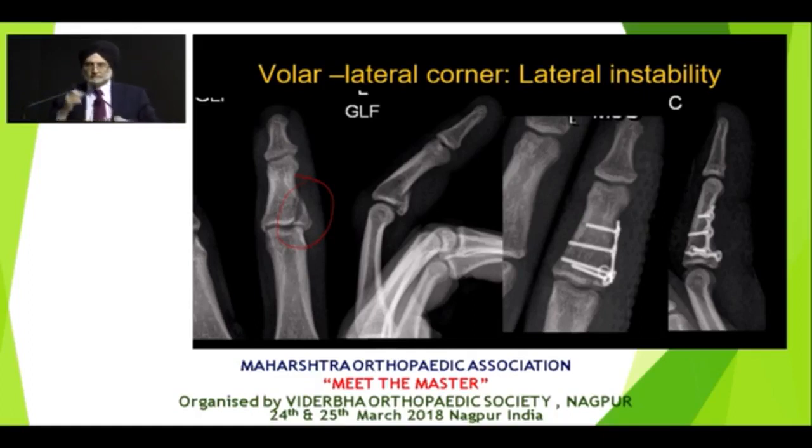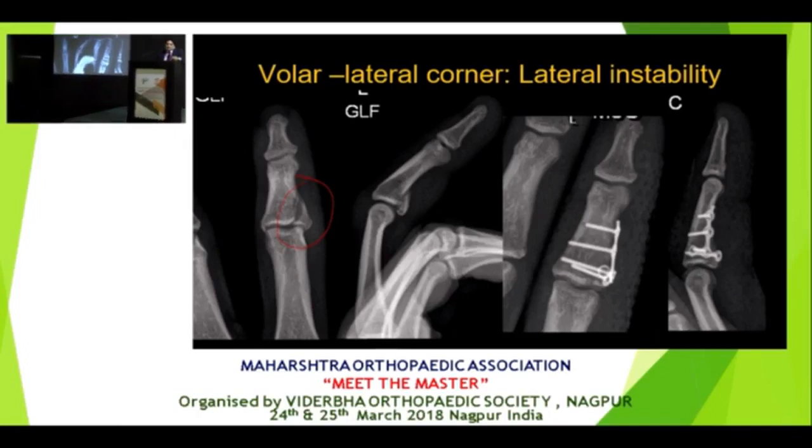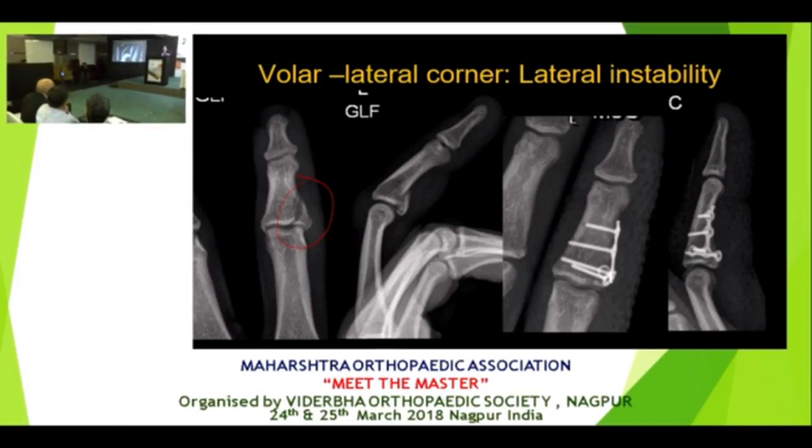Yeah, so Parag. So one comment and one question. We see a lot of these cricketing injuries who present to us with P2 base, like your pilons, what you said. And they come in not necessarily on day one, day two. I do find that the Suzuki type frame is quite excellent for this kind of population. Even when they present late, you put the Suzuki frame and you get them going. Eventually, they get a good outcome. They may not fully extend, but they're very, very functional. Agreed. I think it's a good bailout.